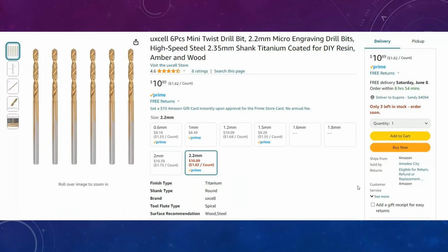I use these drill bits when I'm trying to clean up wax. When I'm doing a wax up on the bar, a lot of times I'll get wax into that channel a little bit, even though I'm using toothpicks to keep that area open. If you just try to use something else to clean it up, it doesn't work as well. But these drill bits, just using it by hand, go out there very well, clean up that hole, and trap all that extra wax inside the drill bit, so it cleans up that area really well. So I highly recommend it, guys.